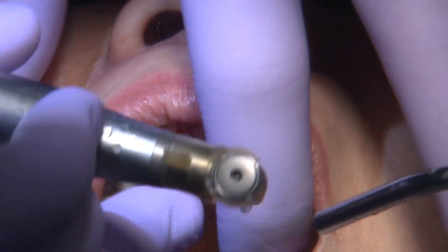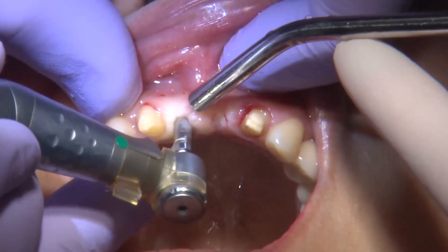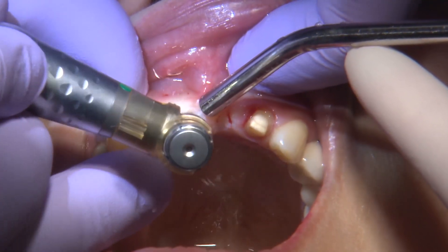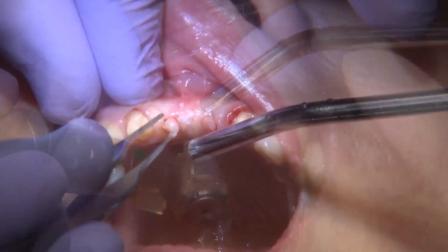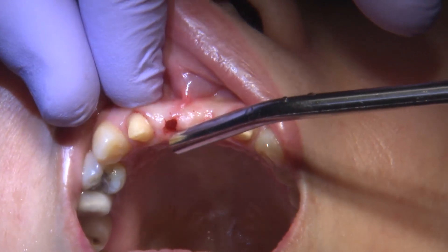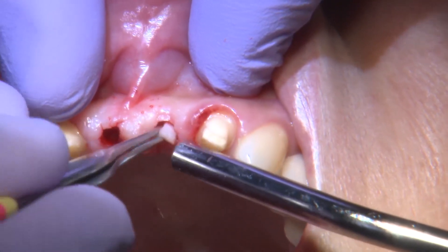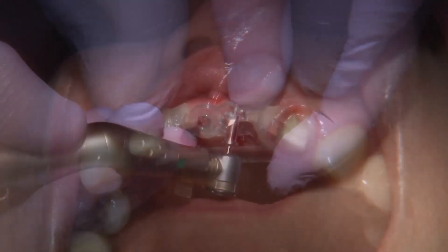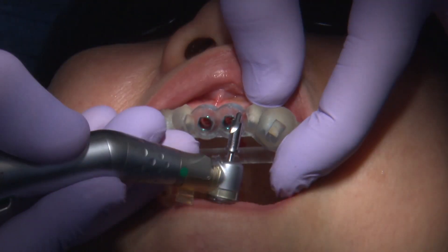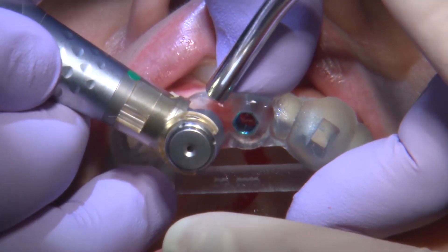We went through treatment planning to ensure I could place these implants mesiodistally, buccolingually, with correct angulation, and make sure that the screw channel is coming through the lingual — so I can have some very nice screw-retained crowns for the end product.